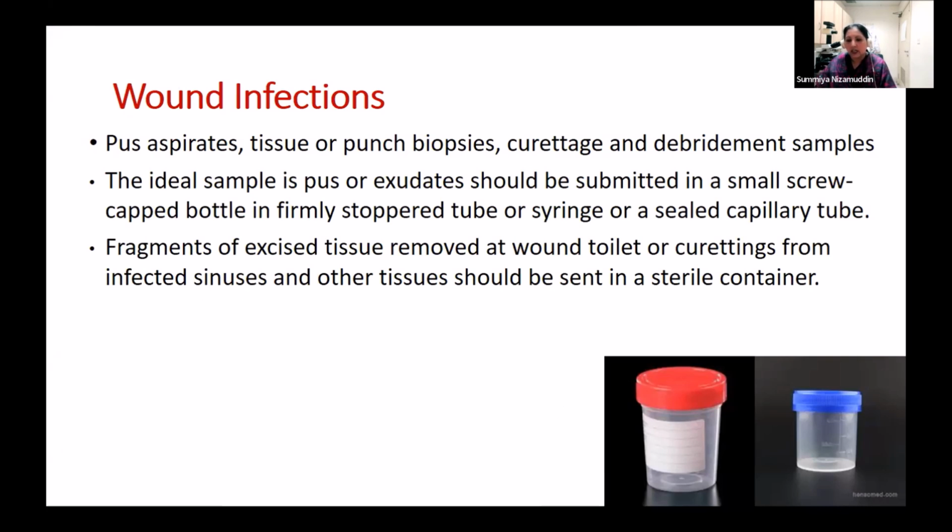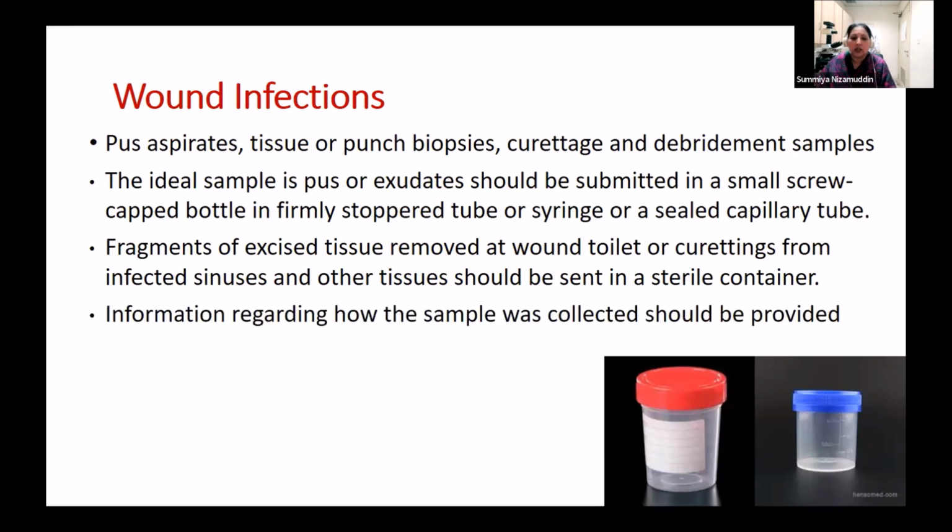Another thing I want to emphasize here: for example, in patients who have sinuses, there's no point in sending wound swabs from the top of the sinus, because on top of the sinus you will only get colonizing flora, and sending a culture sample from there is of no use. It's always better if the infected sinus can be excised and then sent to micro for culture. That information will be more useful for you, because a culture from the top of the sinus will only tell you about the normal colonizing skin flora.